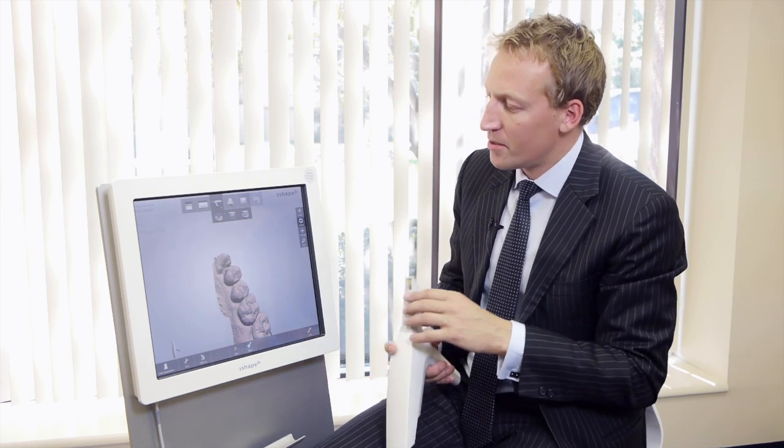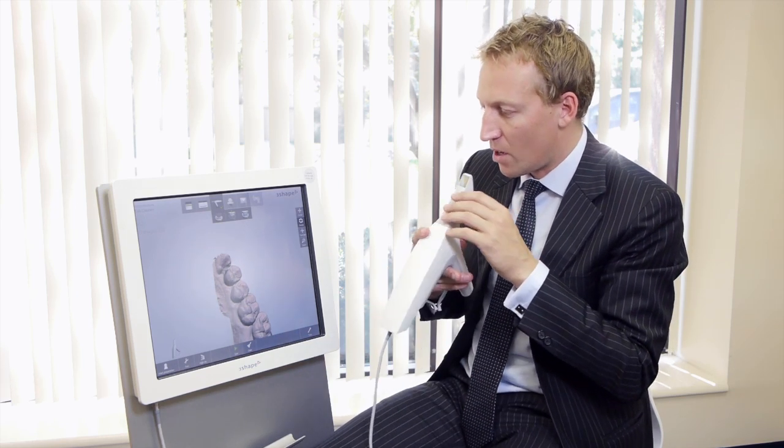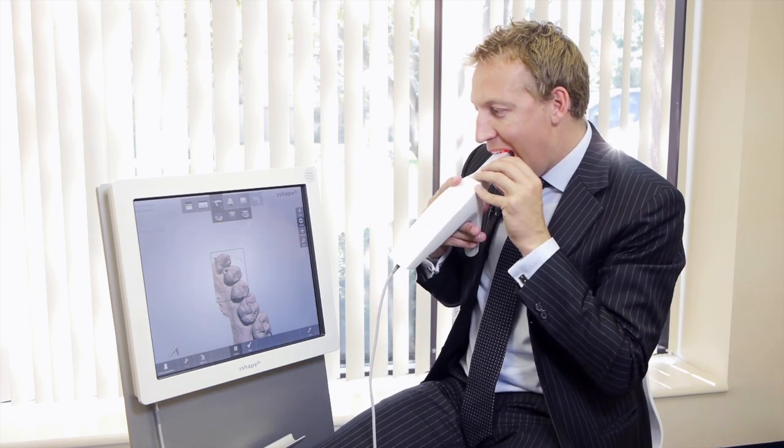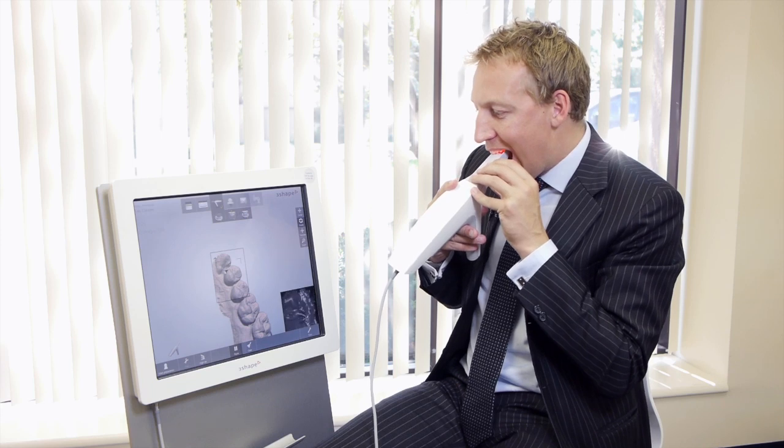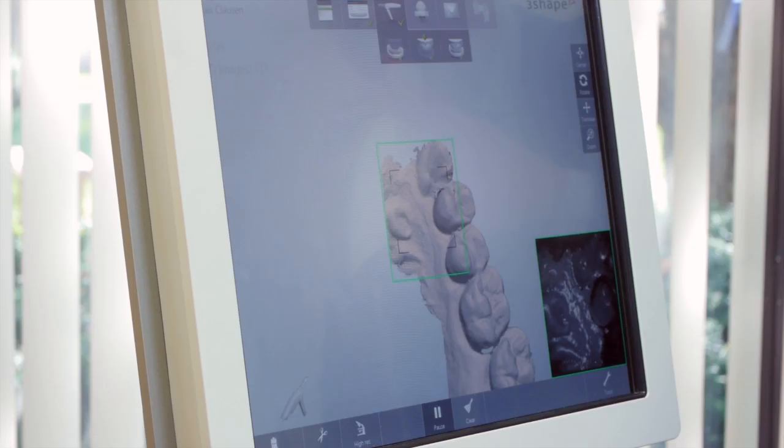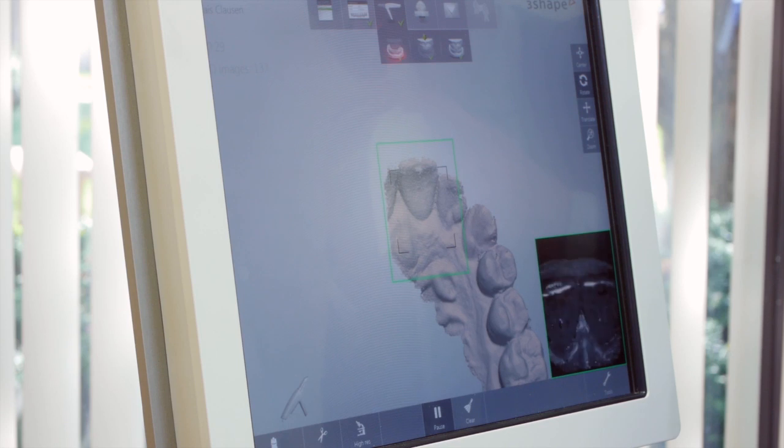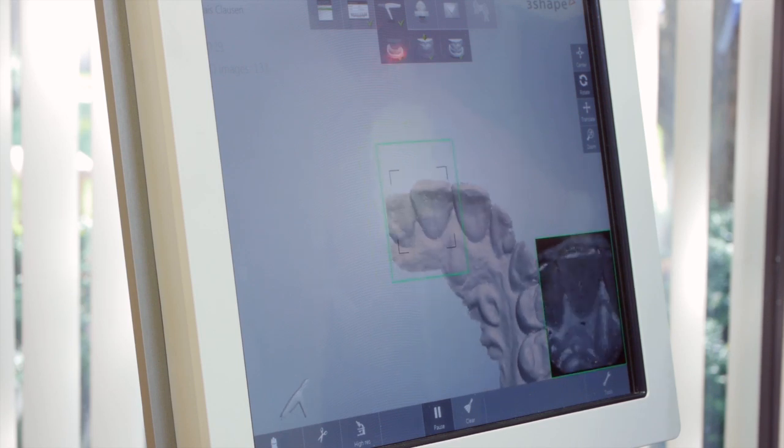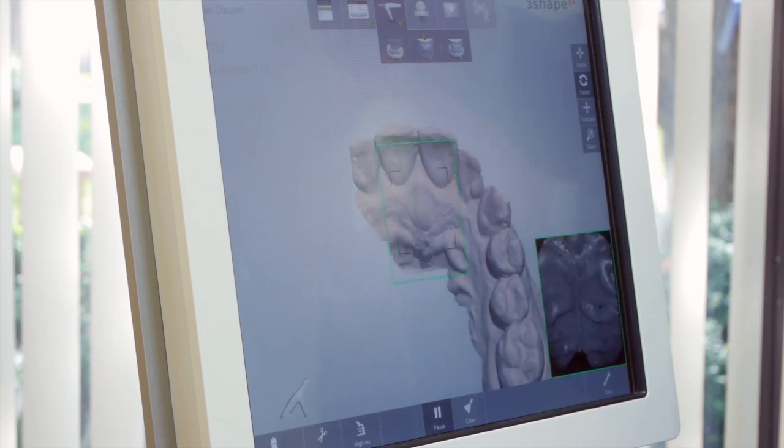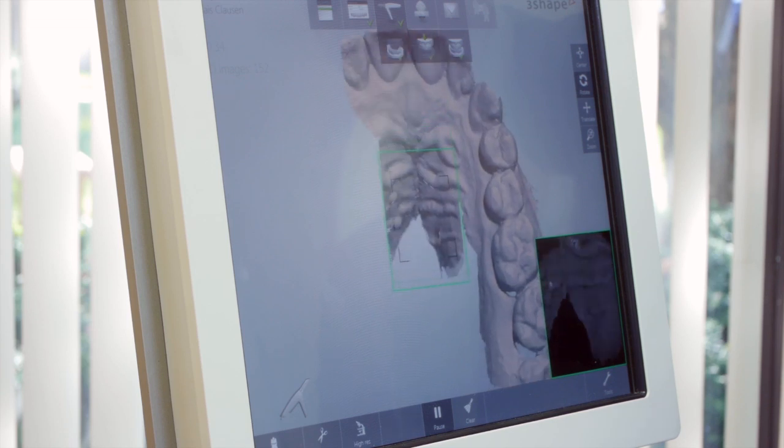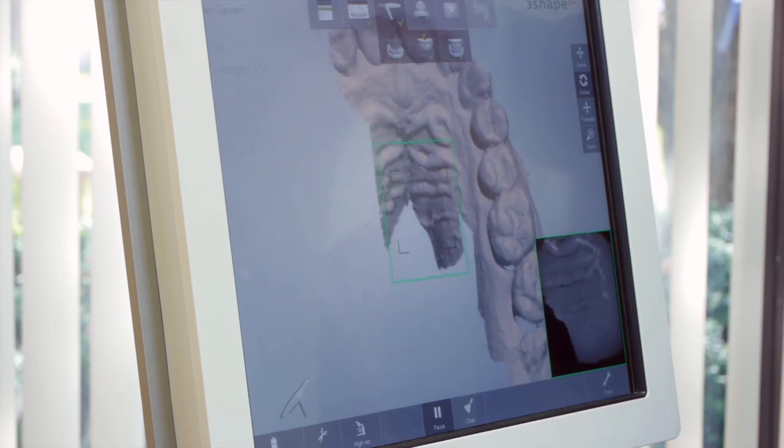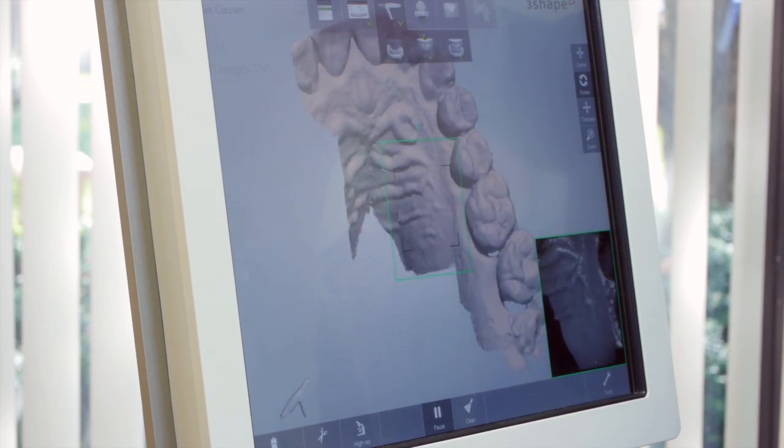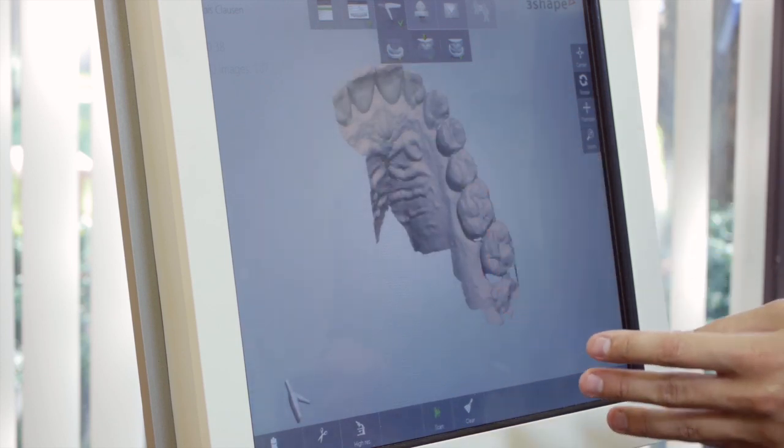Another thing is if you want more of the mandible area scanned, then you can easily do that. You just come back.